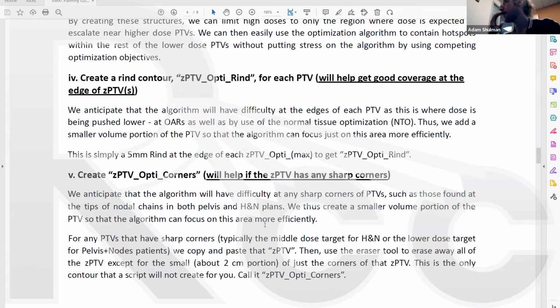Oh, go ahead. Sorry. So my concern is because the dosimetrists draw the OARs and the physicians define the PTVs, if we keep changing the PTVs based on the OARs that dosimetrists defined, I feel like there is some conflict. We just keep changing the PTVs while the doctor thinks that here is the area of the PTV that we need to treat.